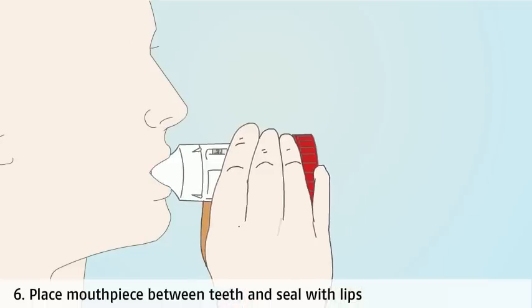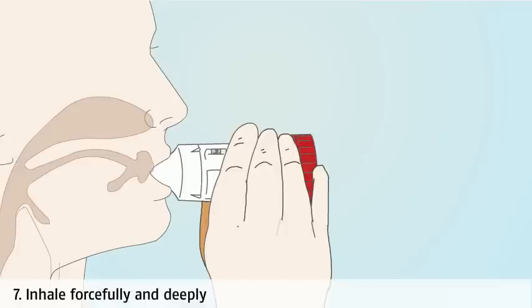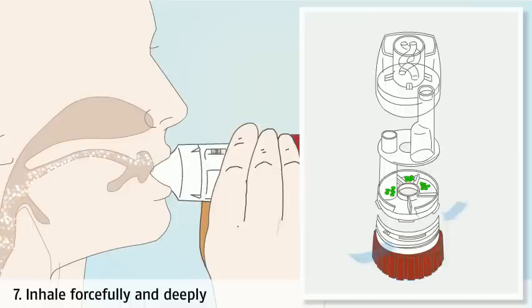Place the mouthpiece between your teeth and close your lips around it. This prevents your teeth being sprayed and creates a good seal with the lips so that the medicine doesn't escape. Breathe in forcefully and deeply. A forceful inhalation is required to draw the medicine deep into your lungs.